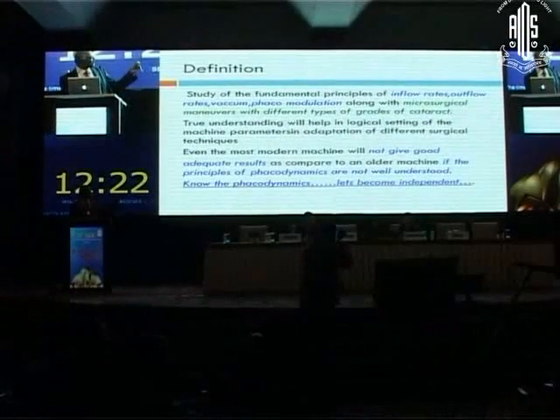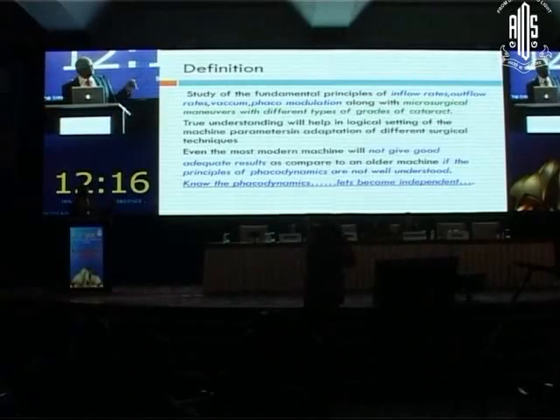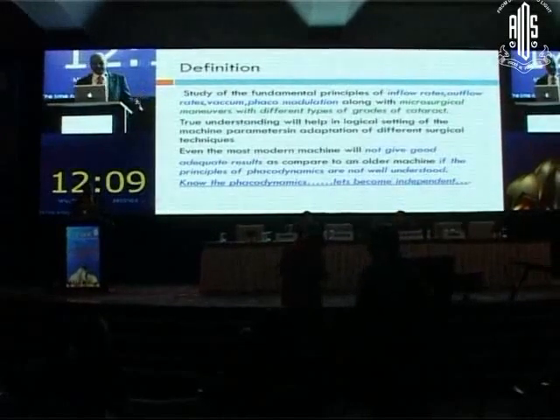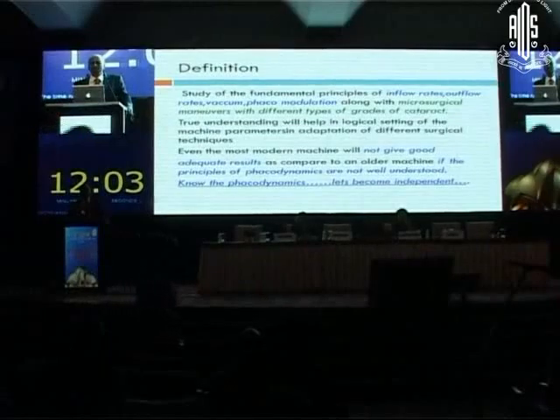Machines will not give good and adequate results, compared to an older machine, if the principles of phaco-dynamics are not well understood. So, know the phaco-dynamics and become independent of the machine. Whatever the machine is, it can be applied for phacoemulsification.